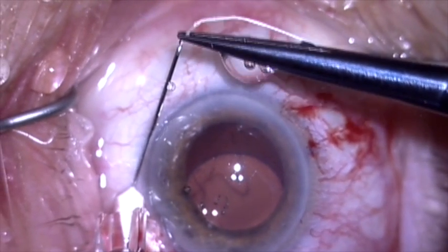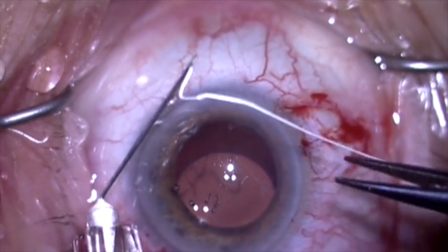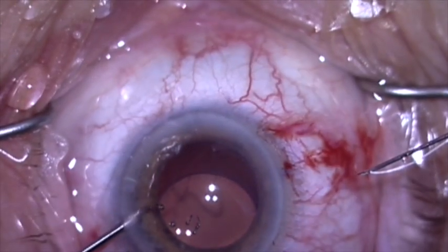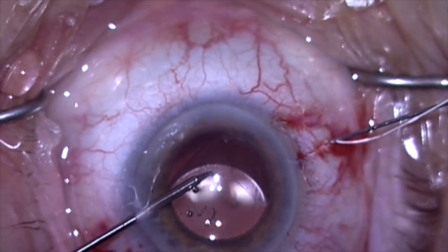I'm now feeding a Gore-Tex suture into the lumen of a wide bore 30 gauge needle, and I'm going to use this to introduce the suture into the eye.